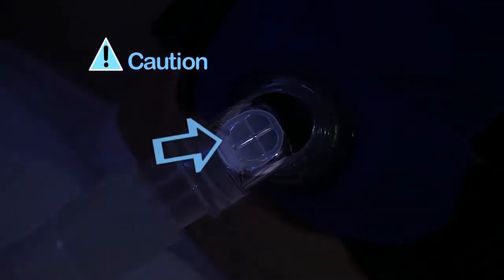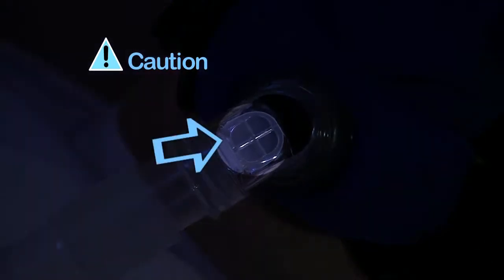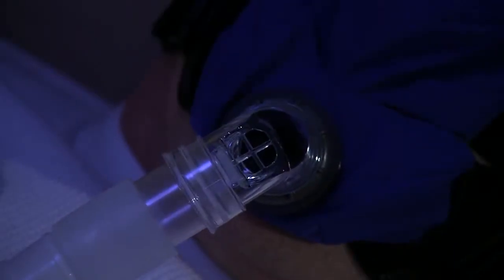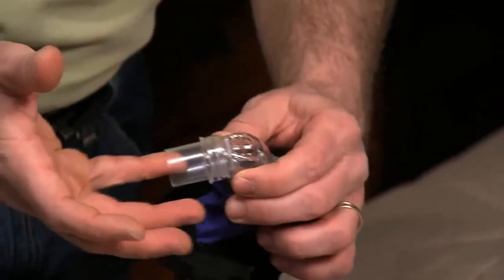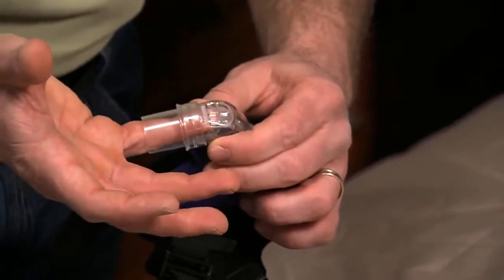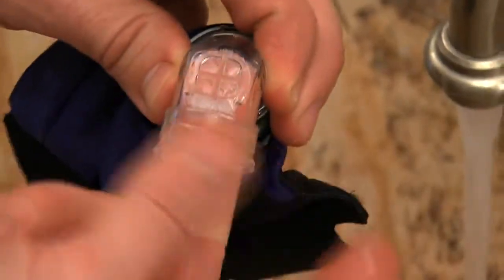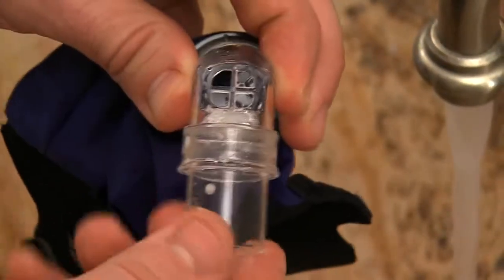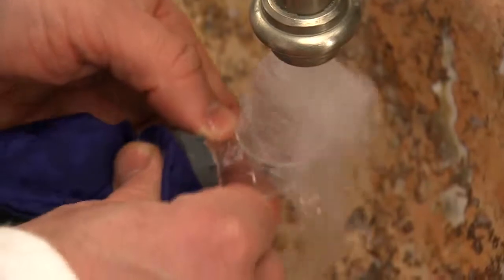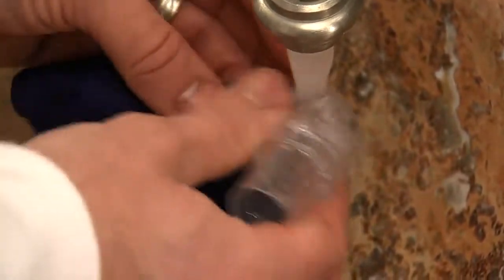Caution: the anti-asphyxia valve is designed to open to atmosphere if the system loses pressure. The user must verify the AAV is able to move between the open and closed position before each use. The user must clean the anti-asphyxia valve daily to ensure all secretions are removed and that the holes to atmosphere are not covered or blocked. Do not block or disable the AAV.